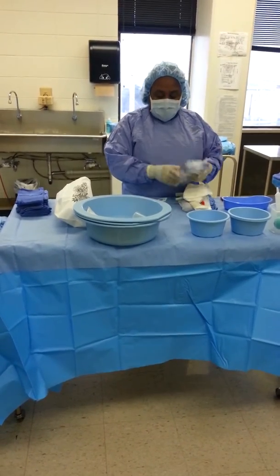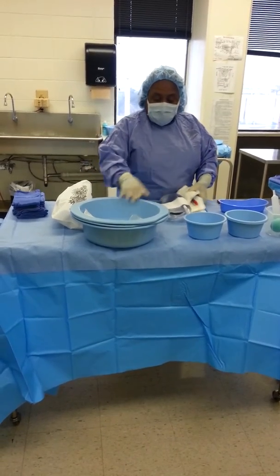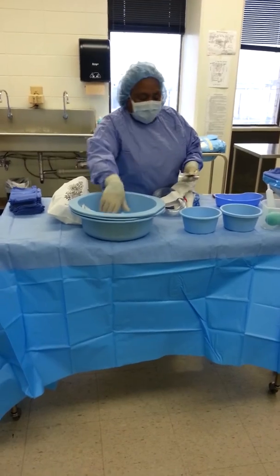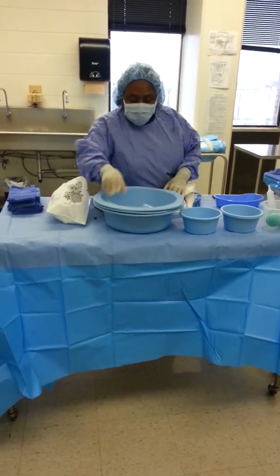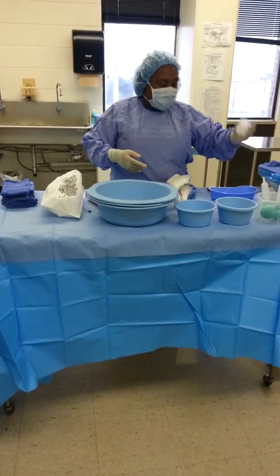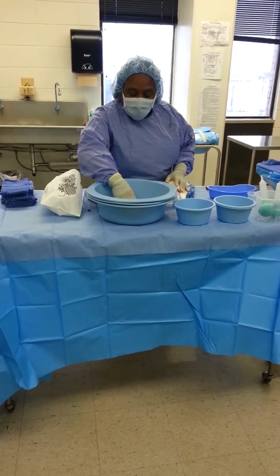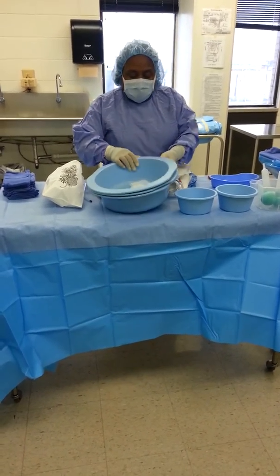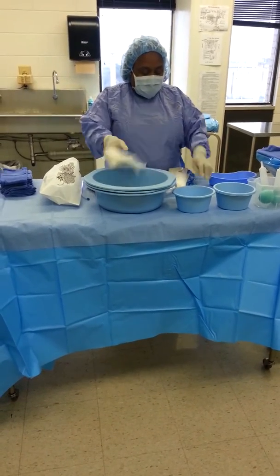Now this set was for a neuro case. That's why you see all this extra. I don't need it. Here's my blades. I have 1, 2, 3, 4 blades. Okay, this is my medicine cup. If they got to give me local of some sort, or some type of injectable. So, I'm finished with all of this. I know I won't need this, so I'm putting this back.